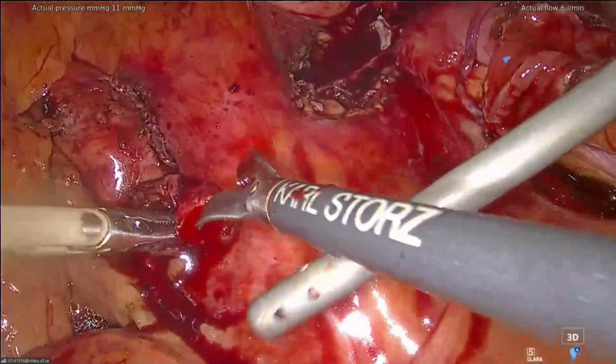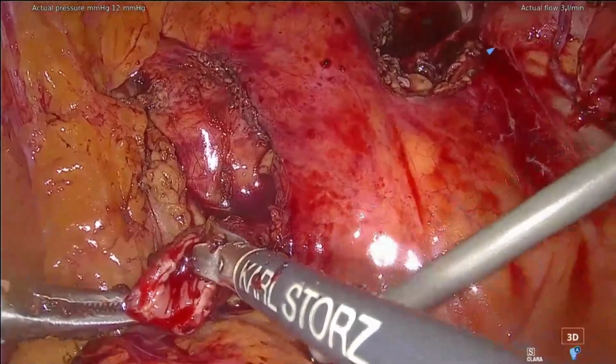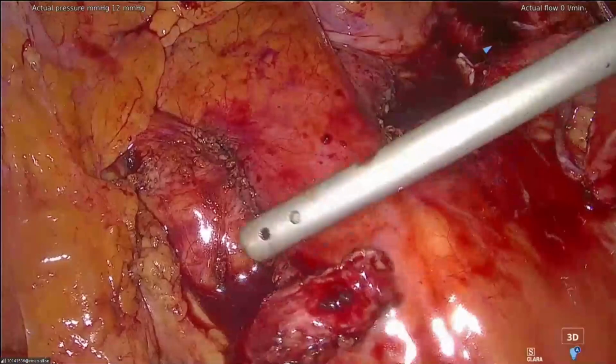I should have a Vicryl 4-0. Yeah, 4-0. No, CT is too big. Show me. Yeah, a small one. Okay, this is the spatula. Remember that it's always the same. We will need to fix it, but we lose the length of the spatula also.